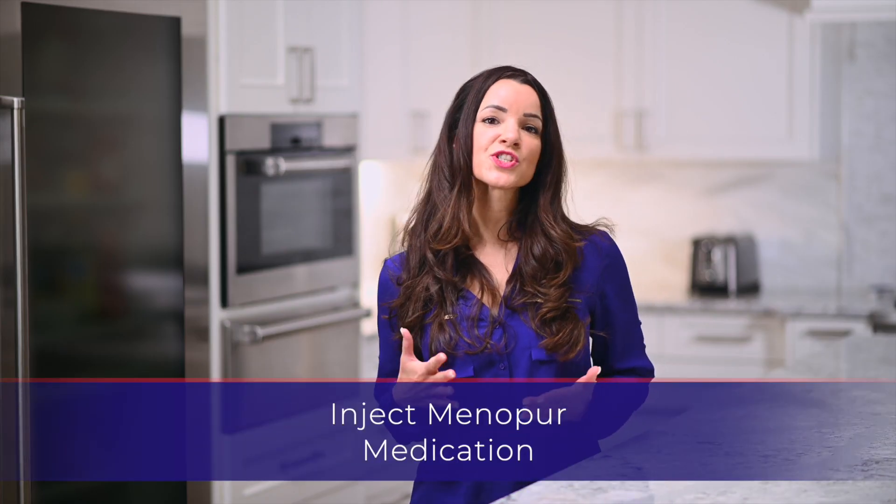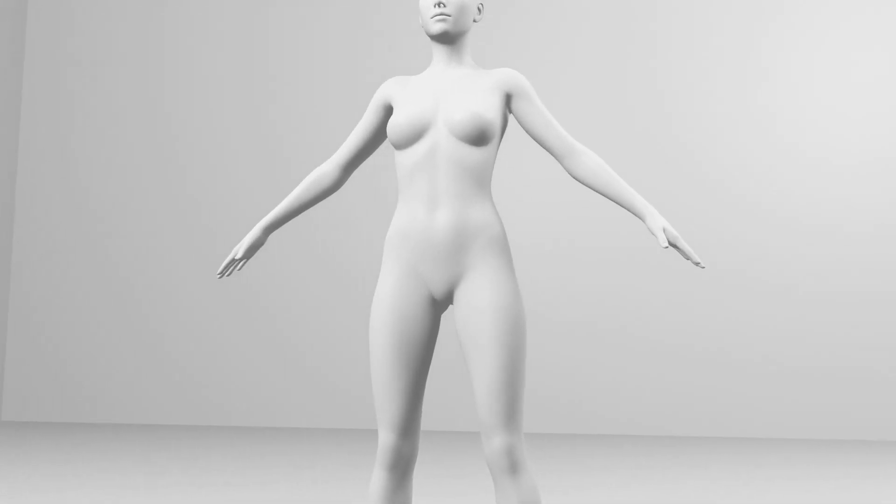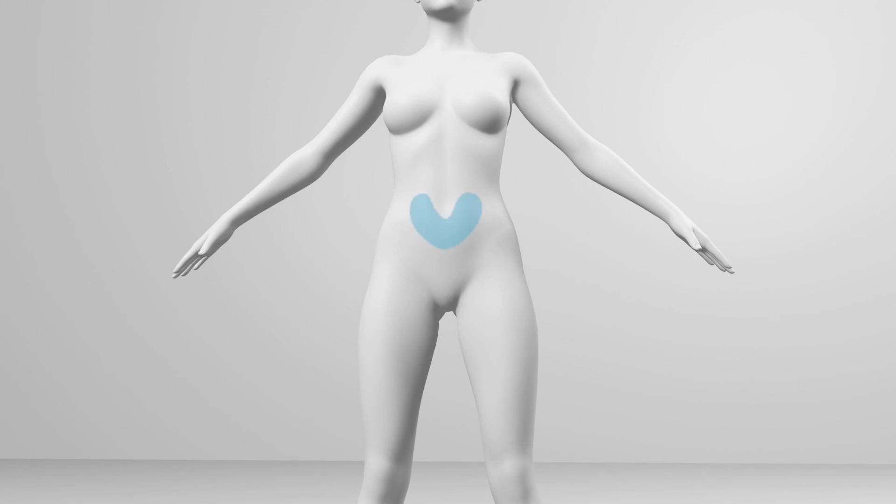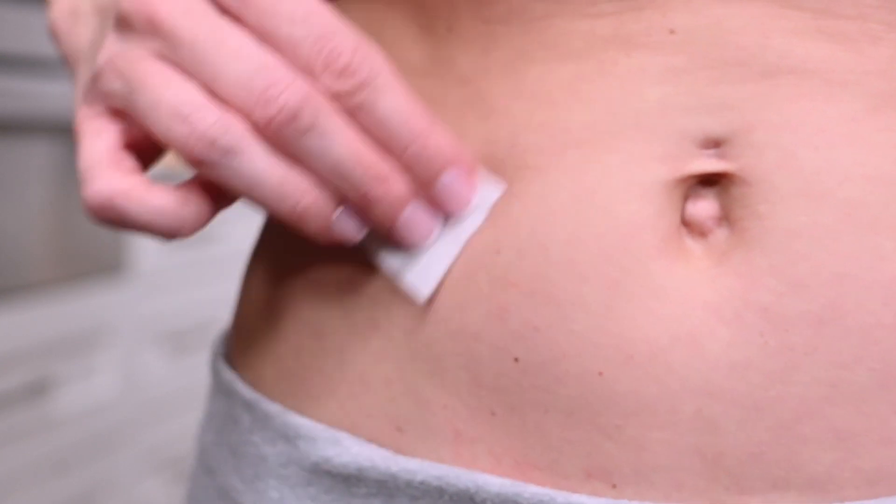The injection is administered in a subcutaneous site specified by your physician. The most convenient site for a subcutaneous injection is in the abdomen around the navel. If your physician has specified that you are to administer this injection differently, for example intramuscularly, please proceed as directed by your doctor or nurse. Wipe the injection site with an alcohol prep wipe and allow the skin to dry. Make sure to alternate the injection sites between both sides of your body.